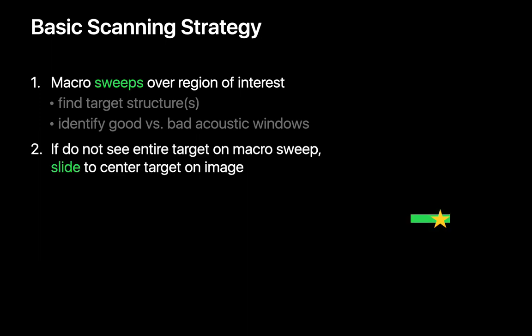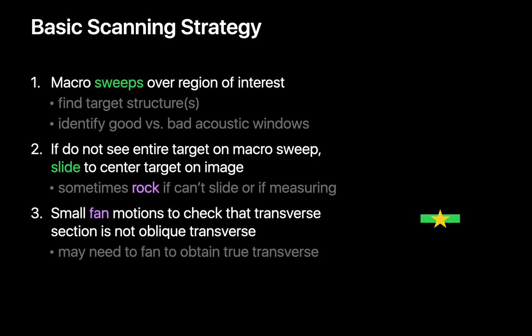If your target is near the leading or receding edge of your image when you find it, slide your probe to bring the target to the center of the image. If sliding isn't an option try rocking the probe to get a more optimal view of your target. At this point I like to use a few small fan motions to make sure I'm not cutting through the target obliquely and confirm that I'm indeed seeing a true transverse plane through the target.